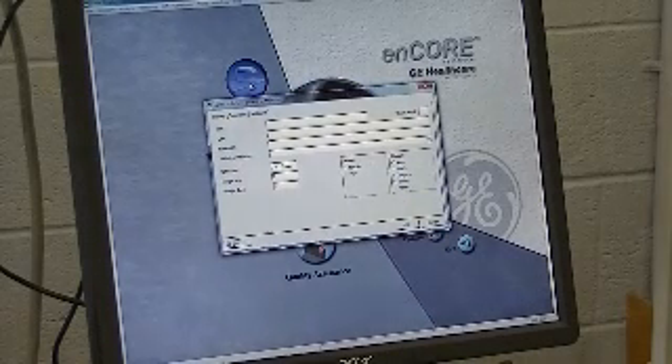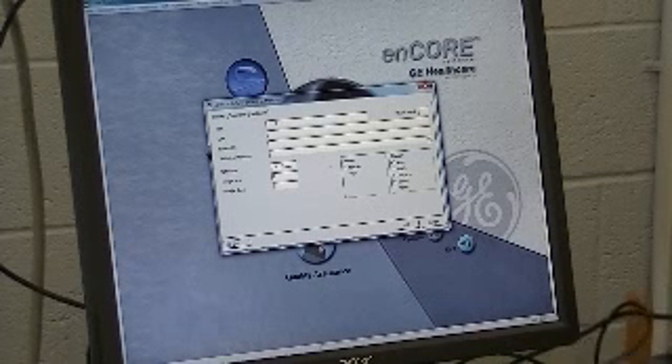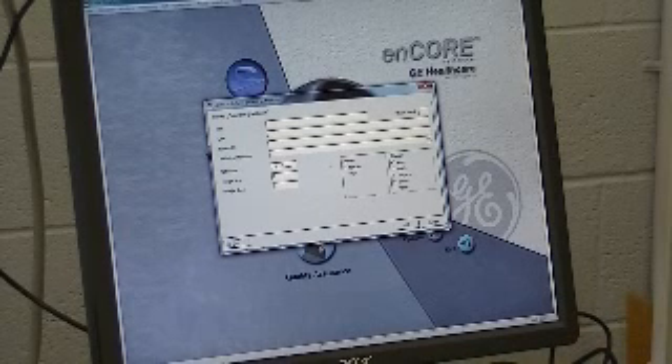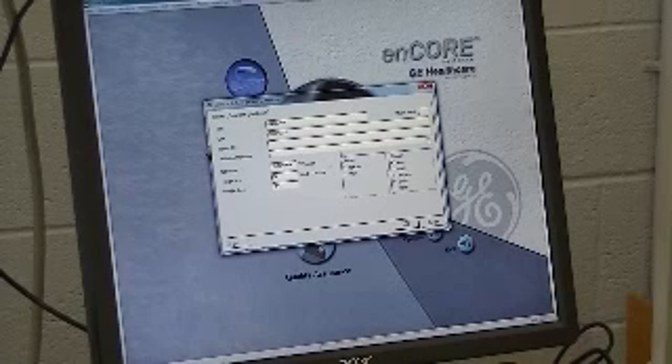Then you want to go to the measure tab. You're going to enter in a new patient. First name is Hacksaw, last name Complete. Birth date: 12/18/1954. Height: 71 inches. Weight: 154. Select male. Click OK.